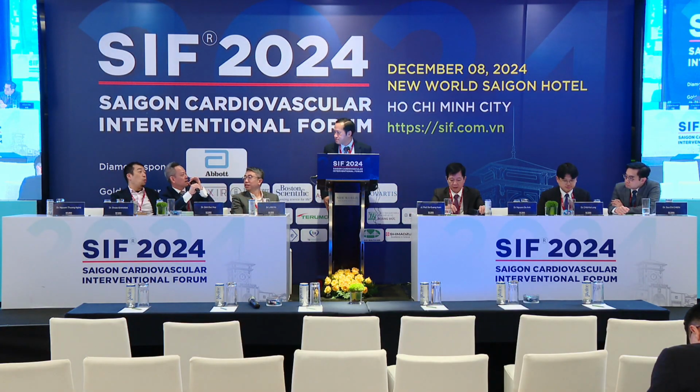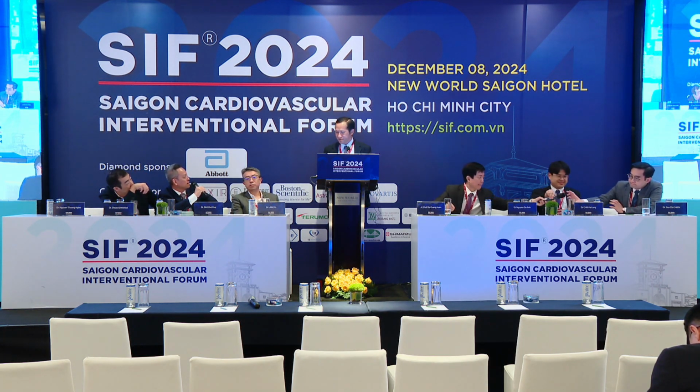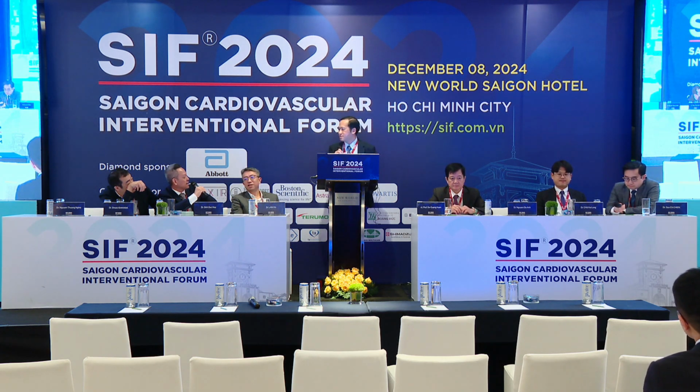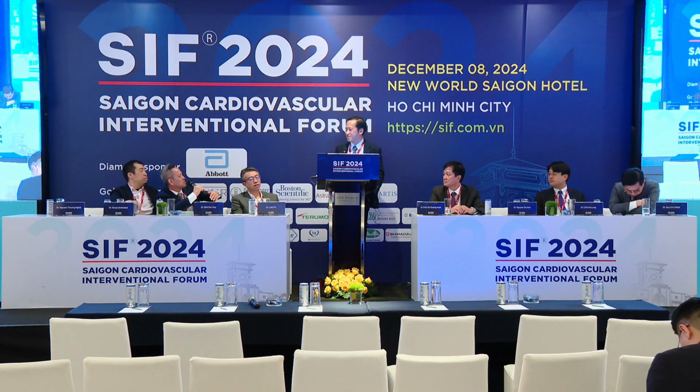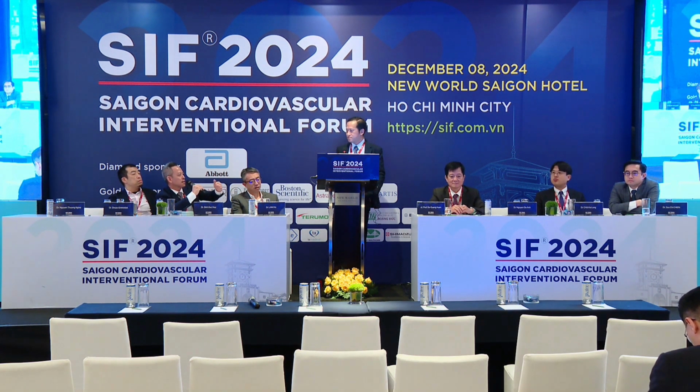Yes, can I ask some technical issues regarding the jail balloon? First, if you decide to use a jail balloon technique, is there any recommendation for the guiding catheter, should it be 6 or 7 French? And the second thing is how do you choose the balloon for the side branch? Can it be 2.0, 2.5? Is it a short balloon or a long balloon? Because some operators say they will choose a long balloon, so that the jail balloon in the side branch will be longer than the stent. So what do you think?